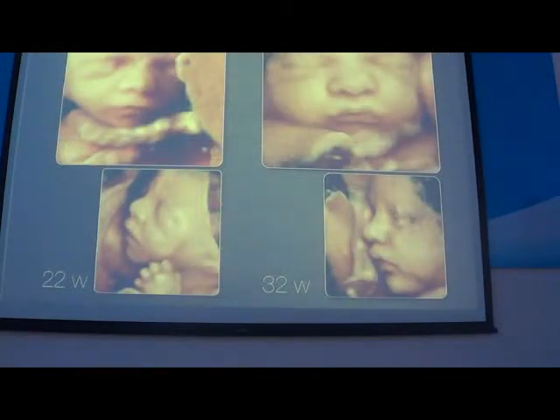You have to know also the different aspects of the baby in the second trimester and in the third trimester. In the second trimester, it's not possible to see the eyelid.